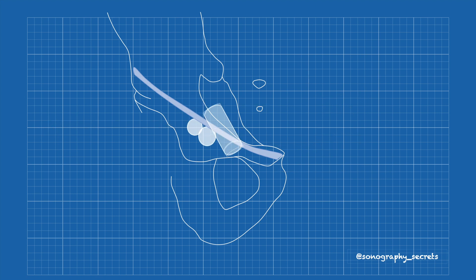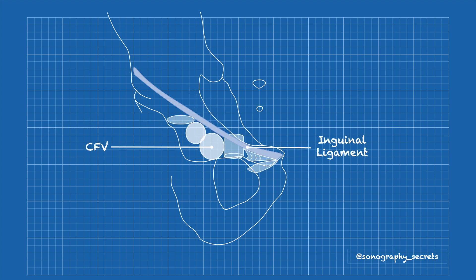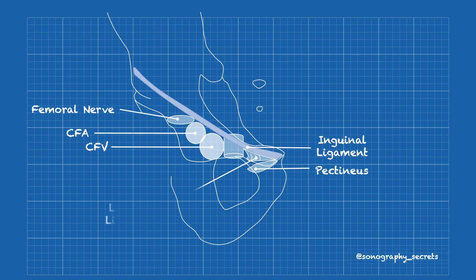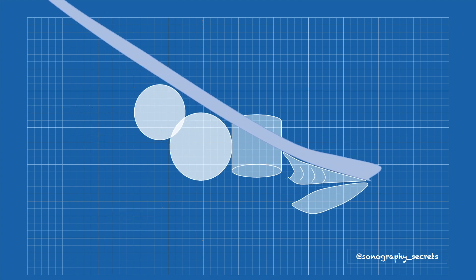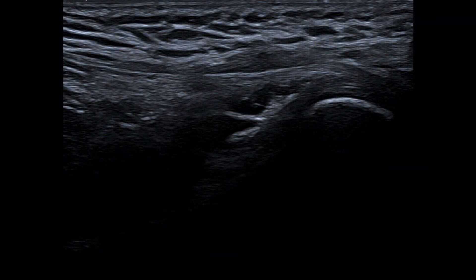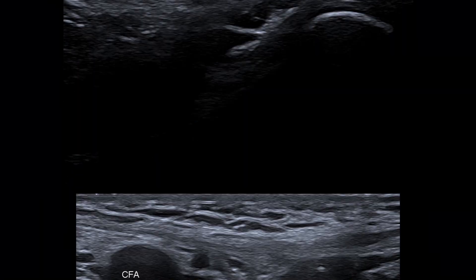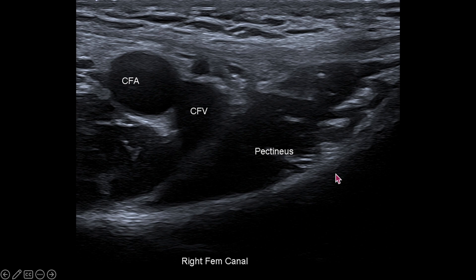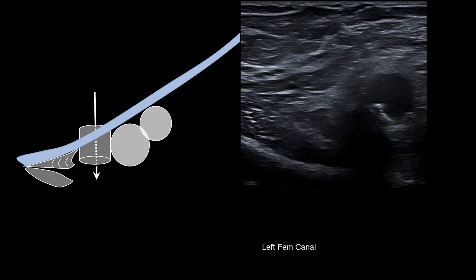For femoral hernias, again, the identification of landmarks is crucial. From our inguinal ligament picture, we move slightly inferiorly, where we can identify the pectineus and common femoral vessels. The femoral canal is located slightly medial to the common femoral vein, and with straining we're looking for movement at this location, which will prevent complete dilation of that common femoral vein. On ultrasound, we identify the inguinal ligament, move slightly inferiorly, and locate the iliopectineal eminence, the pectineus, and the common femoral vein. With straining, we're looking for movement here, as demonstrated in this clip.